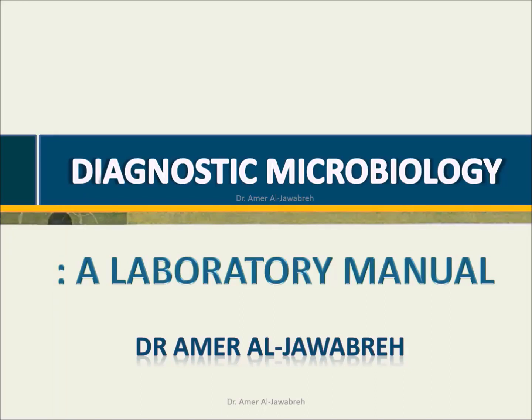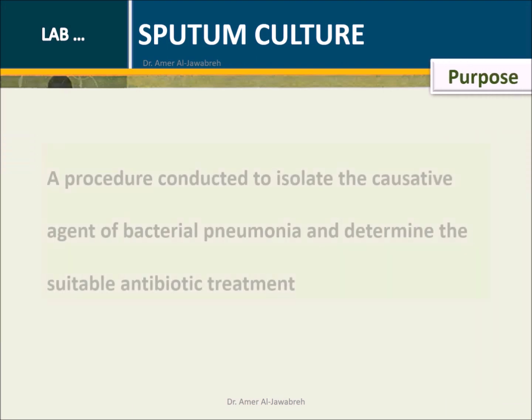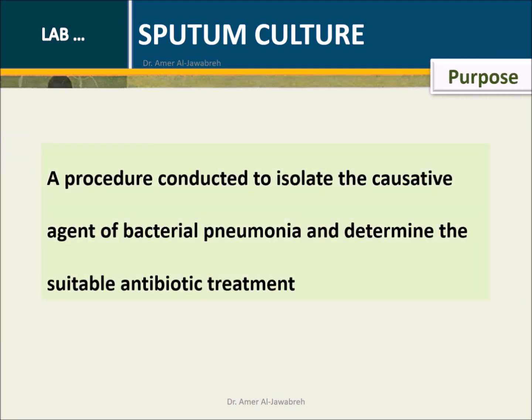Diagnostic microbiology, a laboratory manual. Sputum culture, purpose. A procedure conducted to isolate the causative agent of bacterial pneumonia and determine the suitable antibiotic treatment.